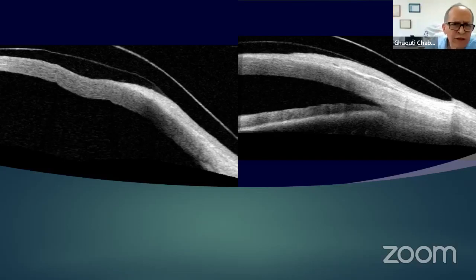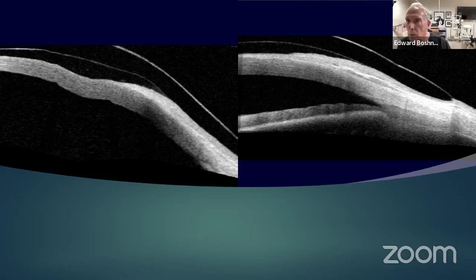For ocular surface complications such as ocular surface disease, dry eye, and so on, how much clearance do you advise people to do with 17? I would try to be after the lens settles down. That's important because sometimes these lenses can drop 100 microns. So after the lens settles down, I would want at least 200 microns of clearance, at least.